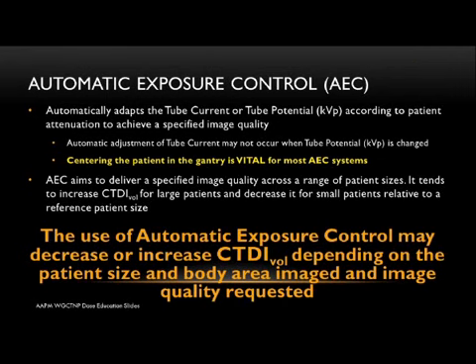And we'll get more in depth into that, but I really want to reiterate that, maybe I'm remiss in saying this, but I think if we all went back to our institutions and really, really focused on making sure the patient was at isocenter, I think a lot of variability in dose for same-size patients, or changes in the dose for a patient from scan to scan, or change in the CTDIvol from scan to scan would probably go away. I think making sure the patient is centered is probably some really low-hanging fruit.